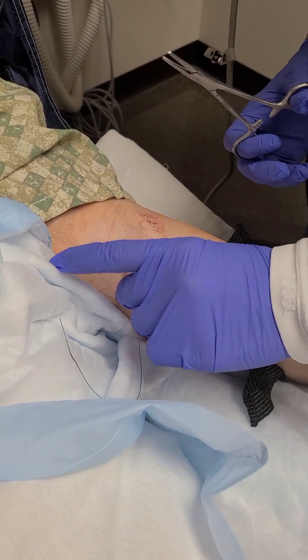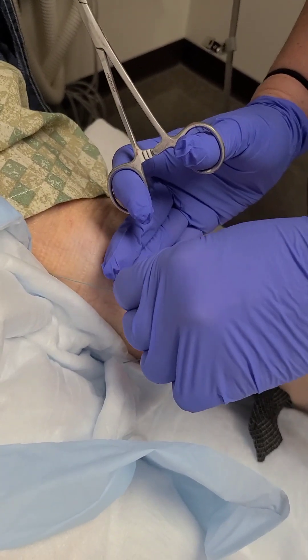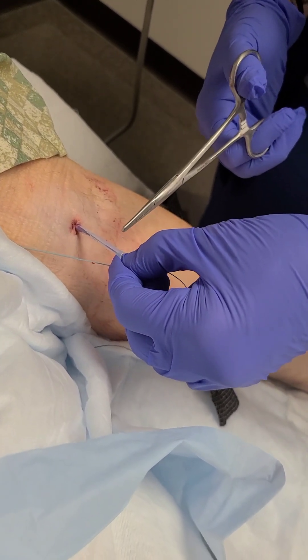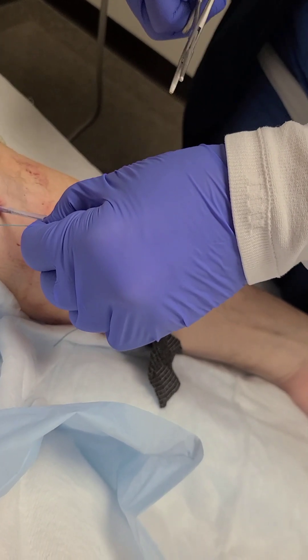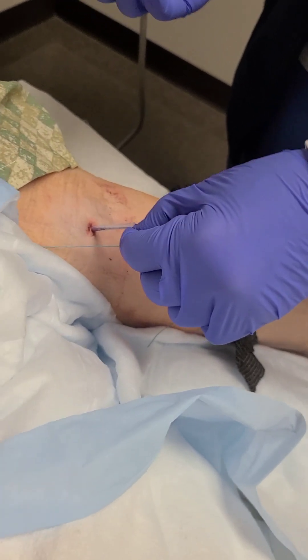Then you pull these sutures, pull them down, push that down so you can hold it. By holding here, you can hold the pressure on this tubing and then put the hemostat back on — and that would put the pressure back on it. Then just wait a little bit longer and try again. I'd wait probably at least 30 minutes.